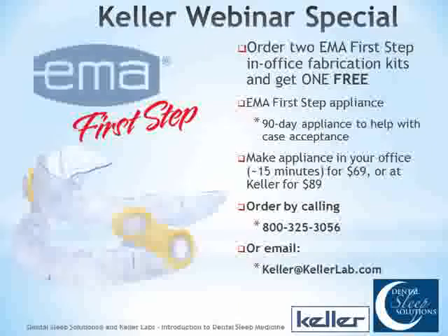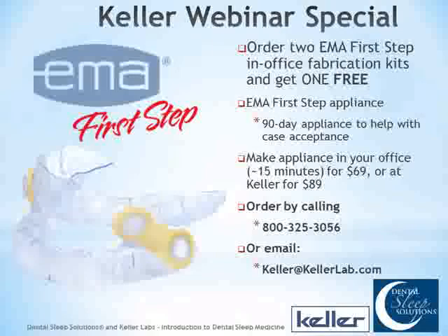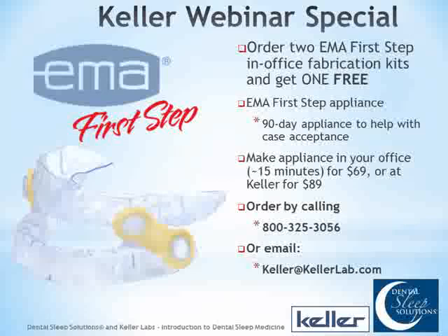Most of these device manufacturers are starting to come out with some type of trial appliance. EMA calls theirs the First Step. It's made by EMA, or you can actually make this in your office. You can get these kits for $69, or you can have Keller make it for $89. In my office it takes me about 10 or 15 minutes to make this. So it's considered a trial appliance.